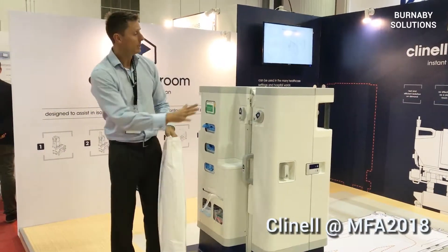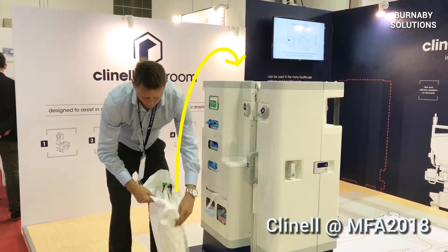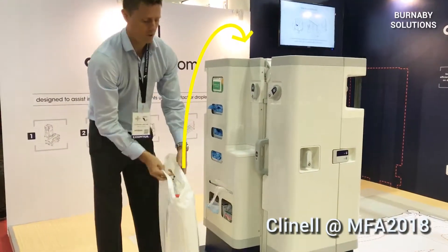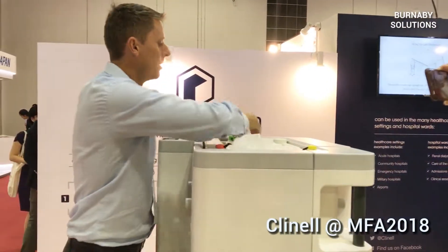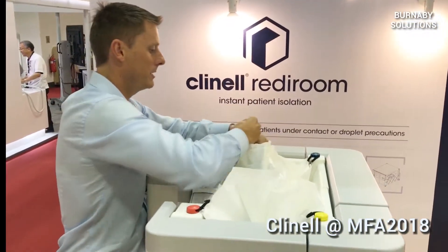We have a canopy here that we're going to insert into the top of the frame. Each is colour-coordinated so you really can't get it wrong. Red to red. Blue to blue. Green to green.